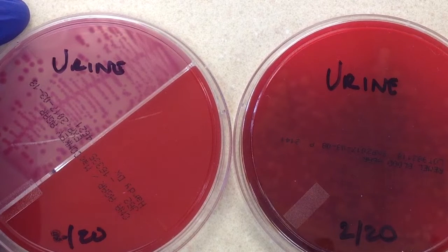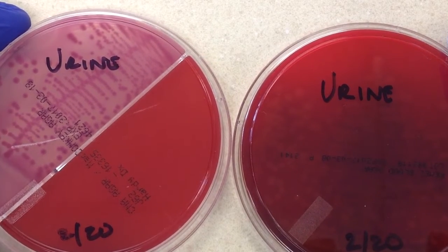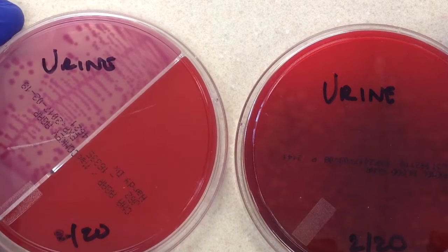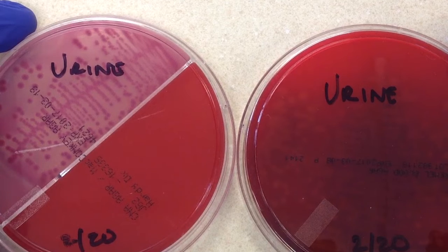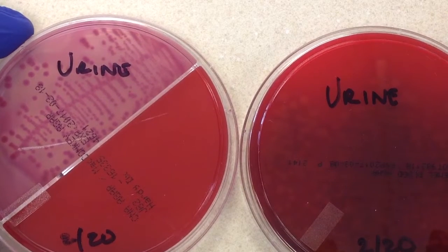Because we're using a calibrated loop — meaning it delivers a fixed, predictable amount — if there are 10,000 colonies as opposed to 100,000 colonies, that's important information for the doctor as far as treating the patient.